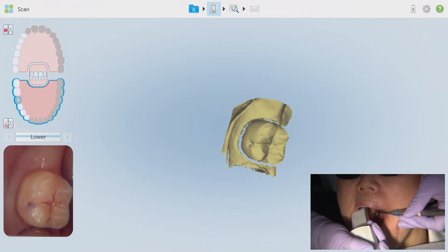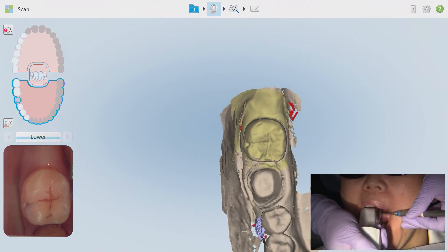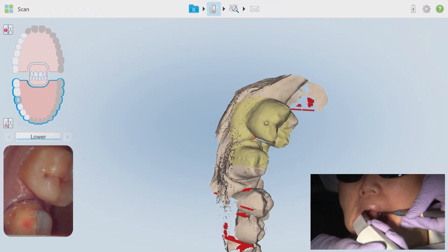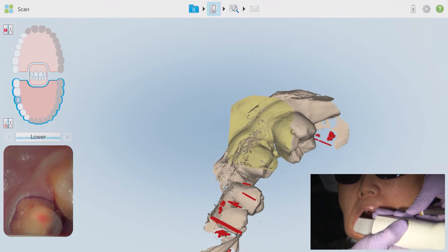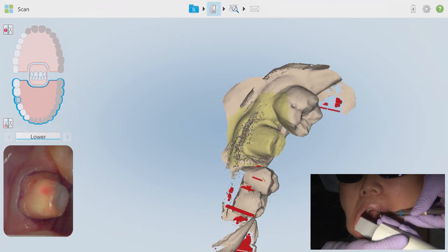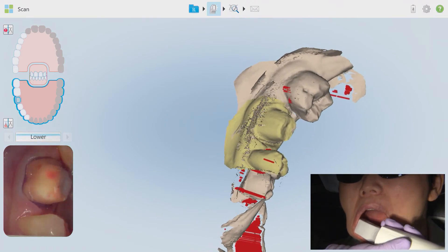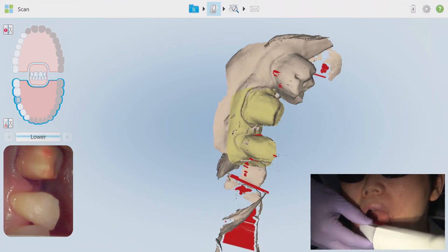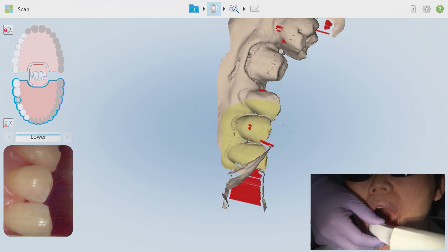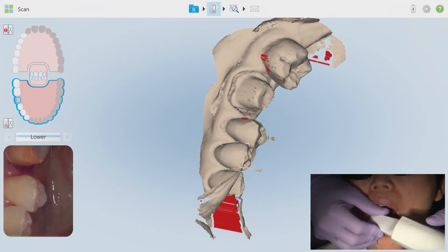Start the buccal scan on the occlusal surface first — make the iTero work for you to first mesh your new scan with the information you've already acquired, and then work your way towards the anterior to capture the new buccal data. A similar exaggerated motion also captures the buccal embrasures and contours. This time instead of twisting the wand, make a rocking motion almost as if you are lifting and dropping the tail end. As I make my way towards the anterior, make a note of my hand position change.